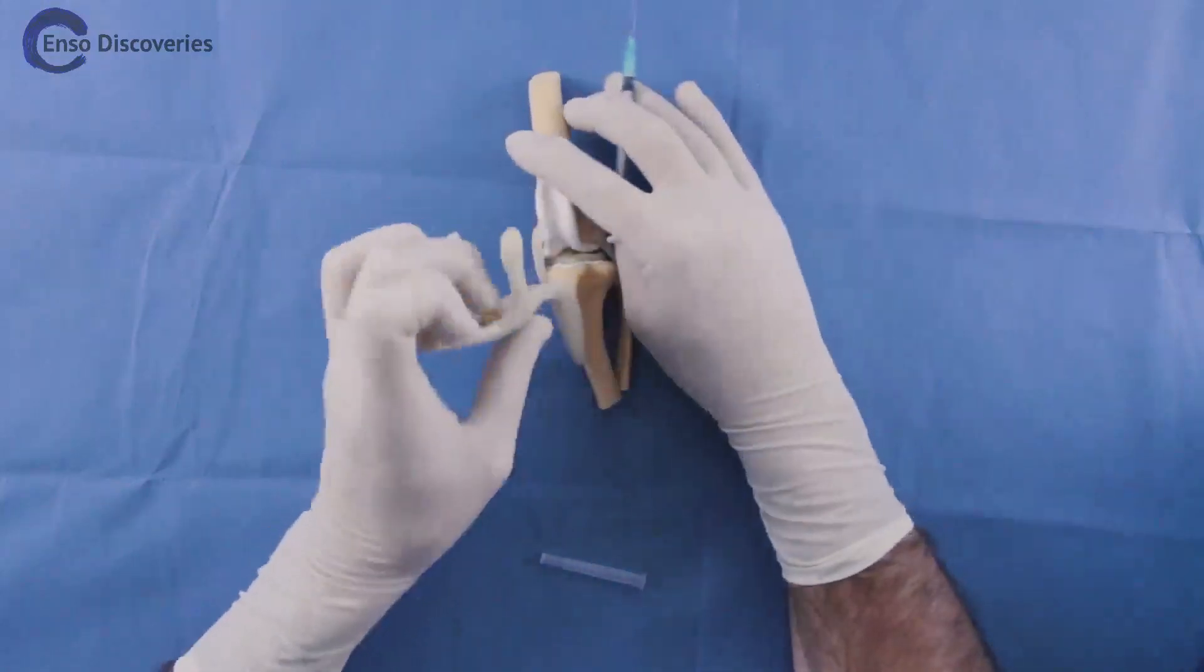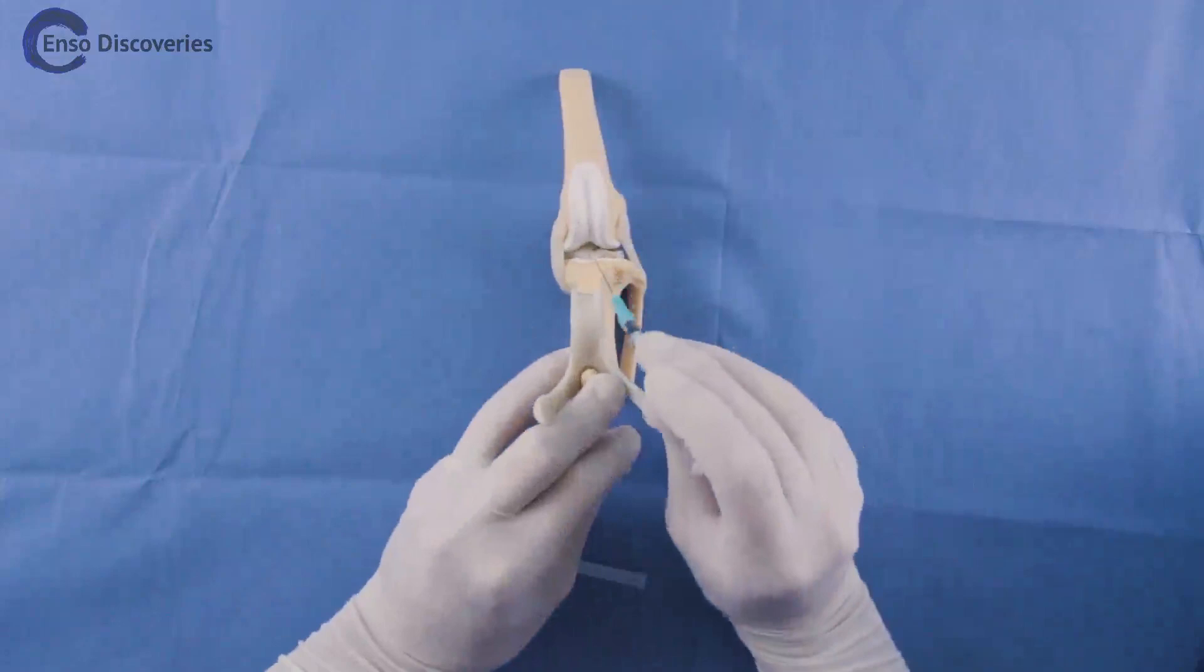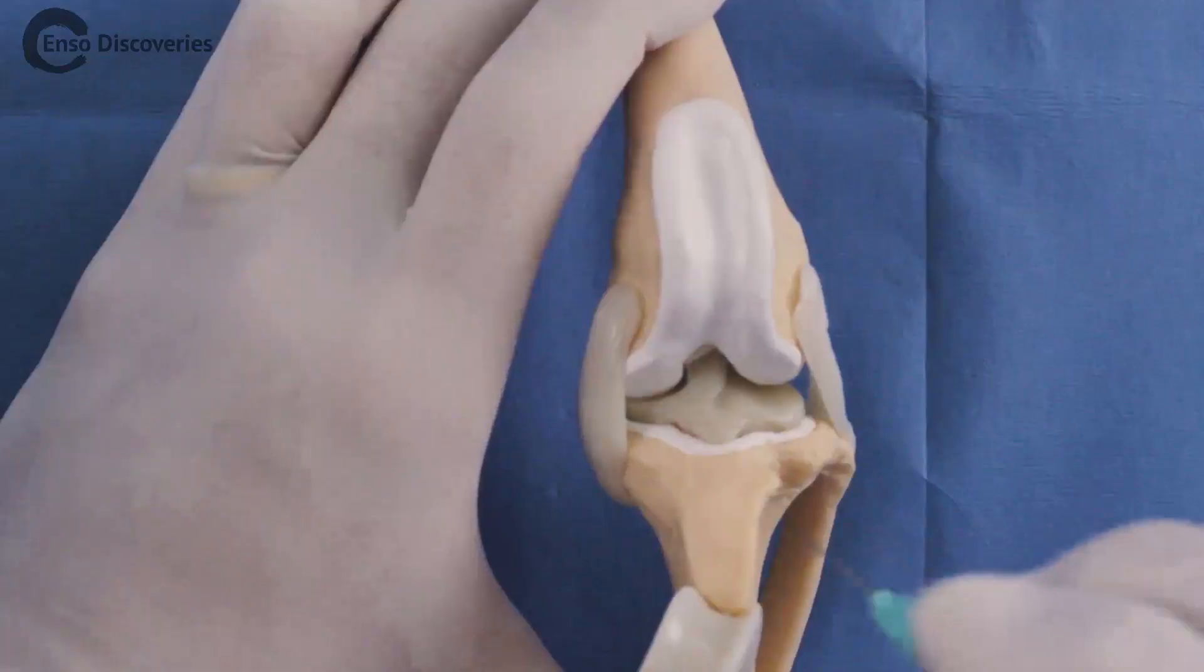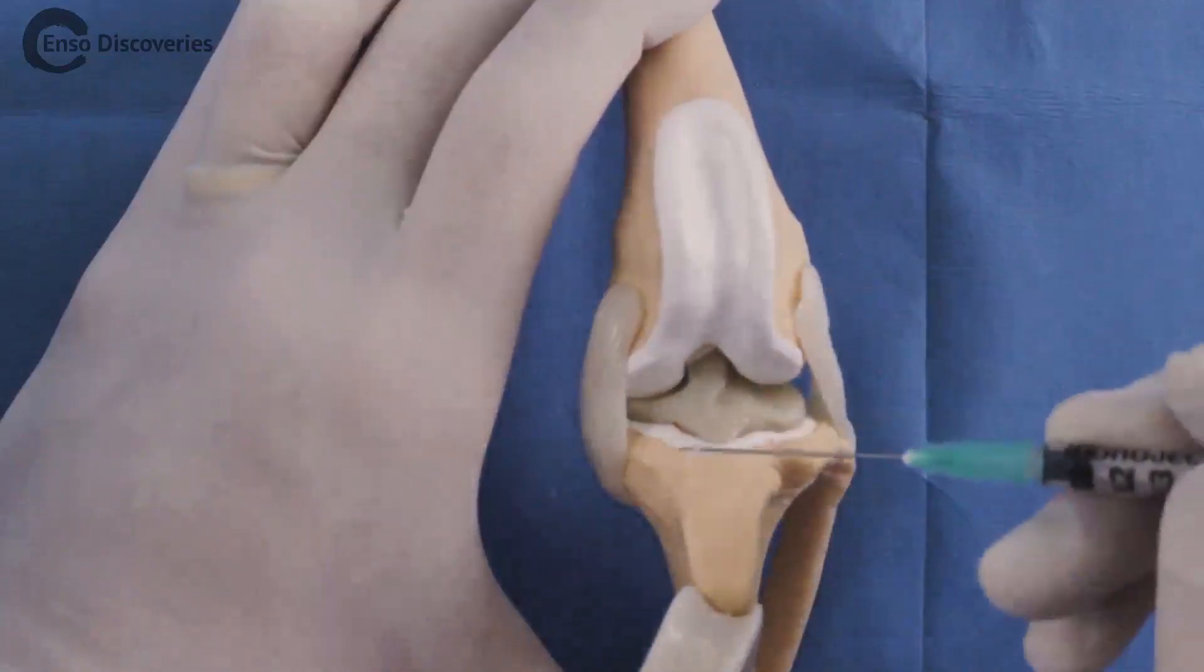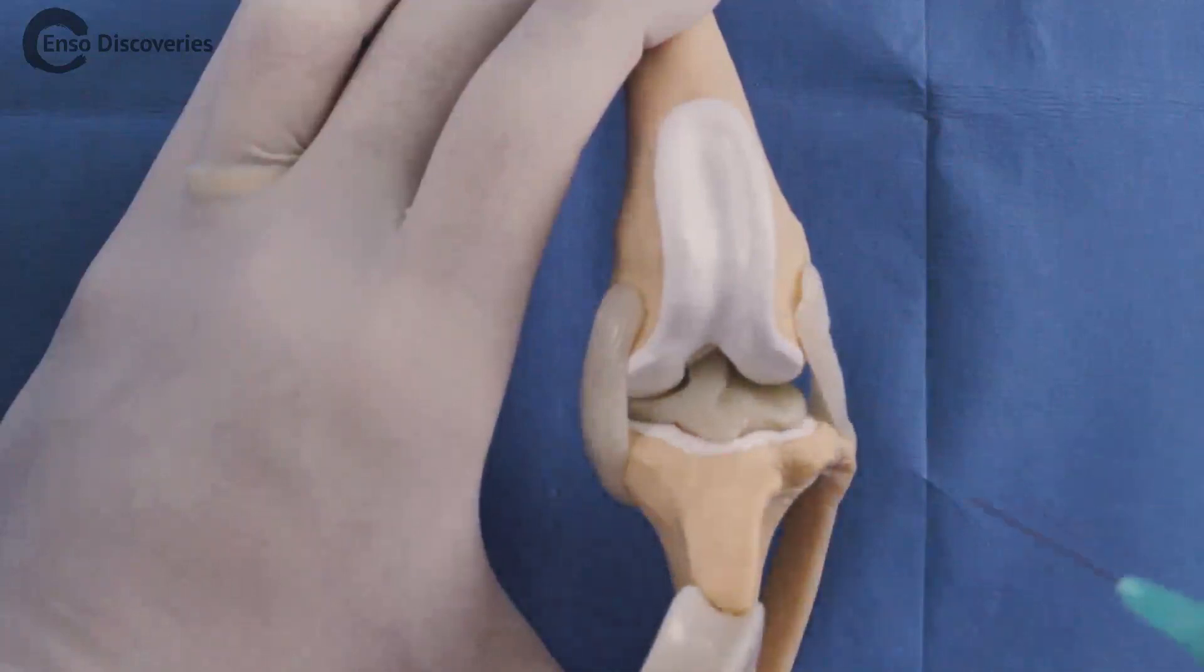Insert the needle in one smooth motion until you hit bone. Your target is the femur at the distal end of the patellar or trochlear groove between the femoral condyles.